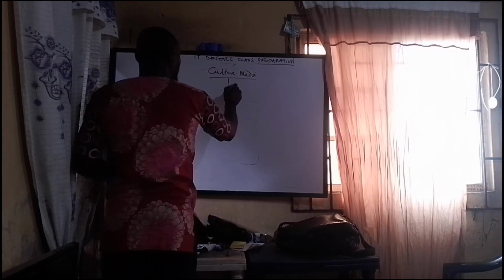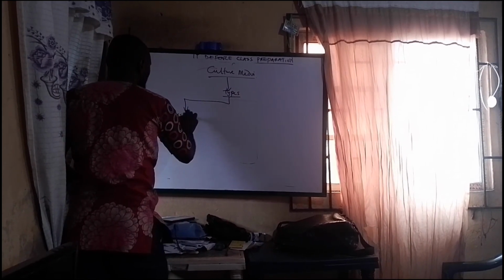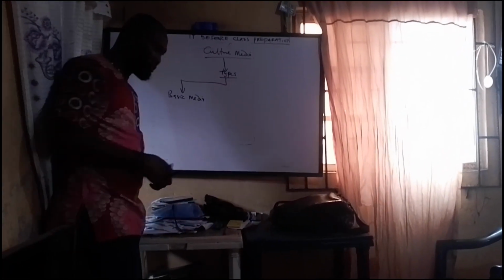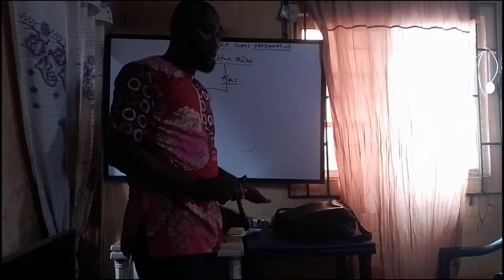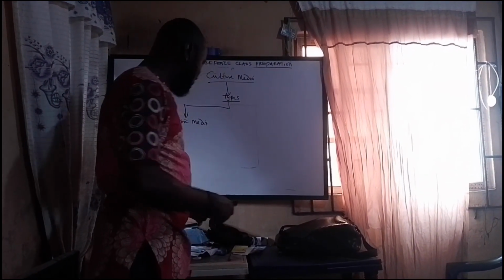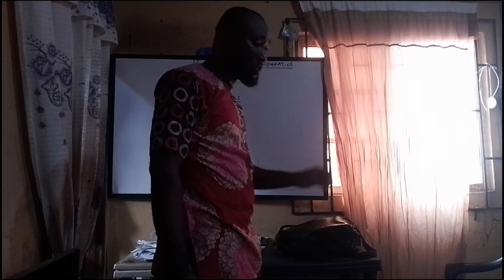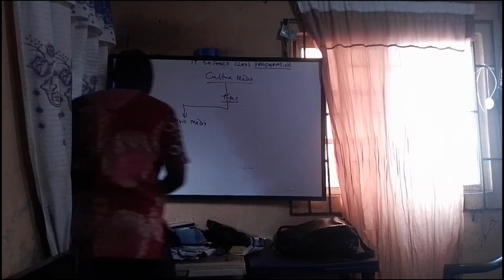So we have basic media under the types of culture media. When you hear basic, what comes to your mind? Foundation. Now, basic media provide support and nutrients for the growth of non-fastidious bacteria.